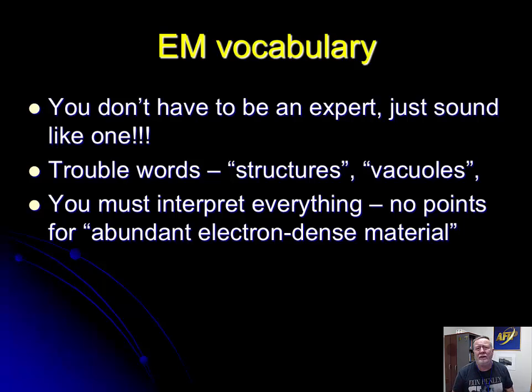This is why you will never describe necrosis on an EM, because it's just a big black blob. It's all covered with osmium. So if you ever find yourself describing necrosis on an EM, chances are you need to back off and get a better section, find another spot on the grid where you'll be able to get some information that will help you.